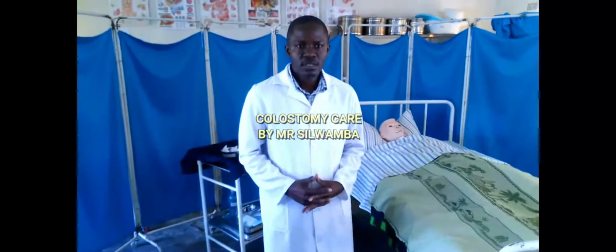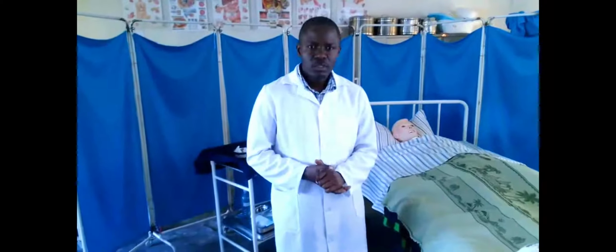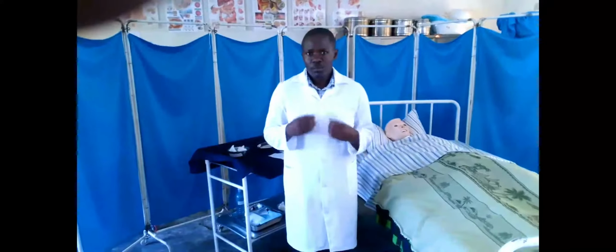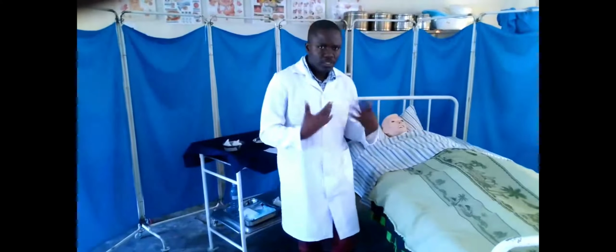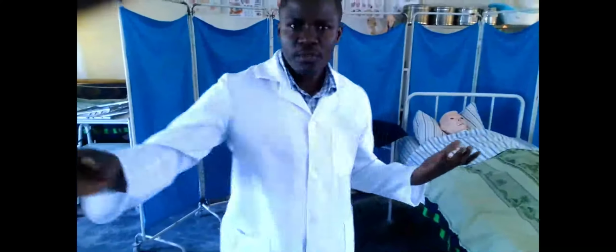I'm back, your host. Today we are doing colostomy care. Colostomy care is a procedure which is done mostly on the surgical wards. But before we go into the nitty-gritties of what the procedure is all about, let's look at the patient first. I haven't yet started greeting the patient and talking to the patient.